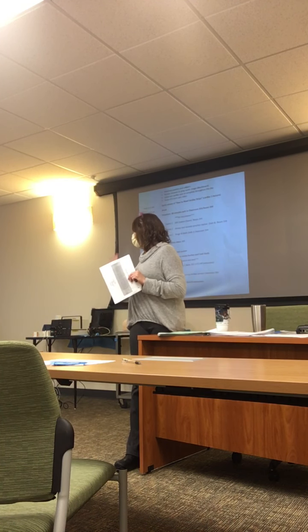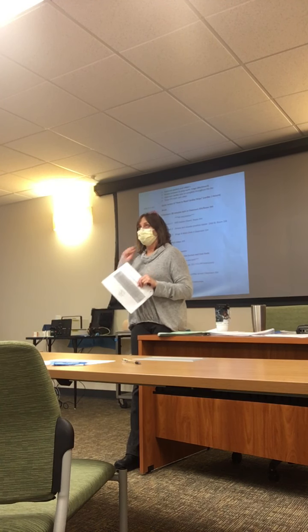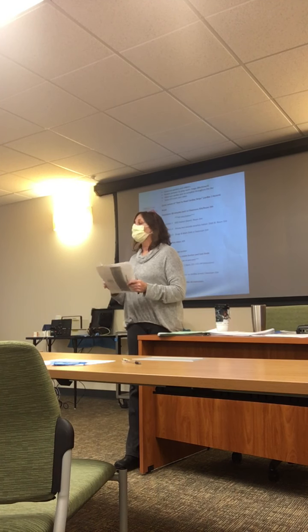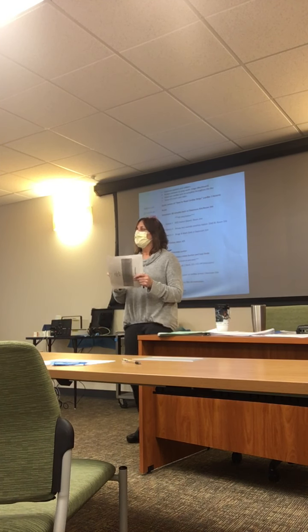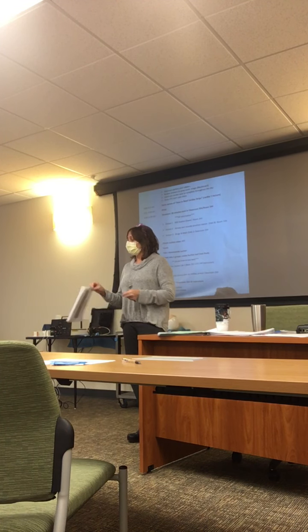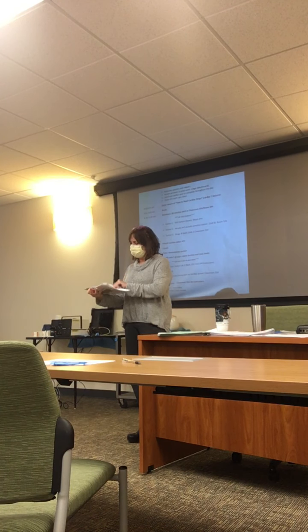And if you get into advanced things, you'll check it in a couple different leads. Hopefully it's in a very fine VF, but I'm not going to get into that because it's not going to make any sense to you guys. Not a good rhythm. All right, and I think we are almost ready to change, but I'll just quickly go over. The next rhythm is VT, I think you guys have.